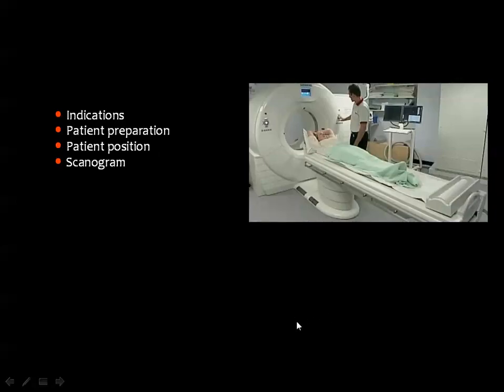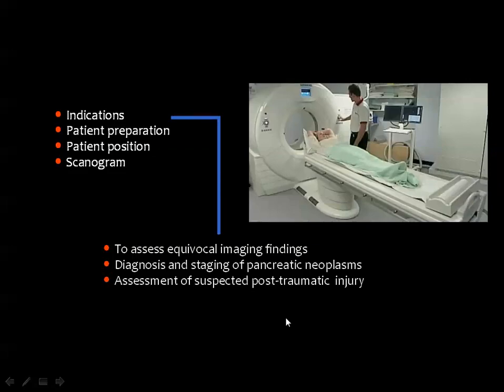And we'll concentrate here on the role of the CT scan in assessment of the pancreas, because you all know that usually the pancreas is masked by gases during ultrasound examination, and the results are usually not sufficient, and the MRI has a limited role in the evaluation of the pancreatic pathology. I will explain this during my talk.